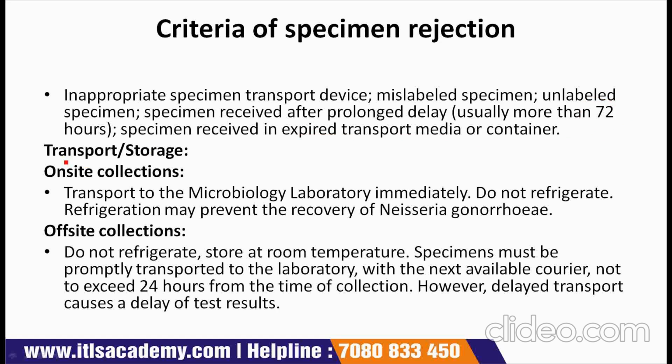Next topic is transport or storage of specimen. On-site collection. In the on-site collection, transport to the microbiology laboratory immediately. Do not refrigerate. Refrigeration may prevent the recovery of Neisseria gonorrhoeae.